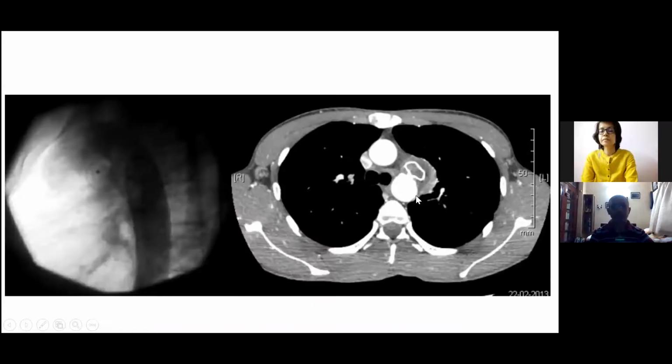And this was the angiogram equivalent of the CT scan. And as you can see on the repeat CT scan, this aneurysm has totally solidified with the clot, and this is the descending thoracic aorta, where there was no obstruction anywhere.